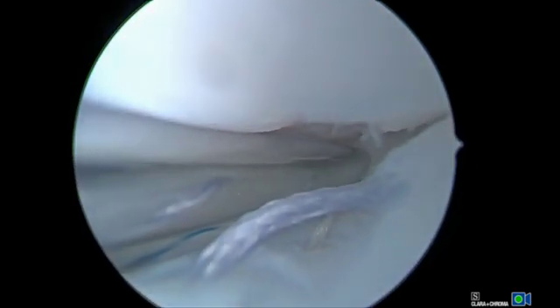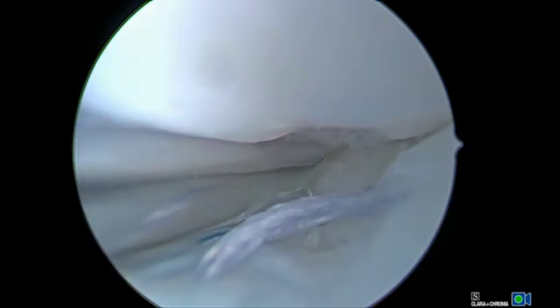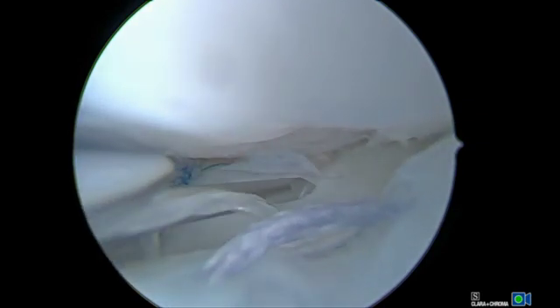Then, using outside-in technique, a total of four horizontal mattress sutures are made over the vertical mattress in a tie-grip, rip-stop type format to repair the meniscus, creating a super hashtag orientation.